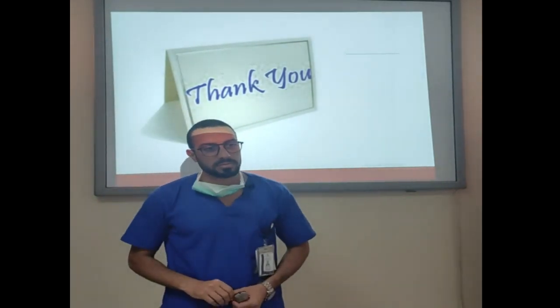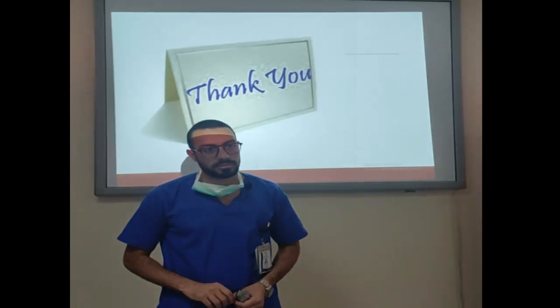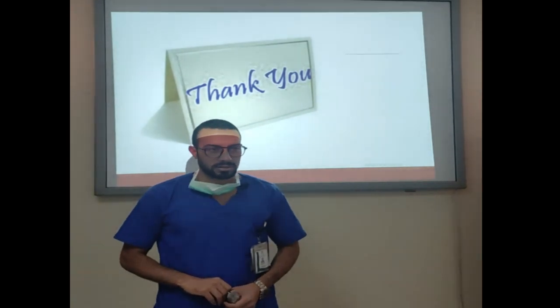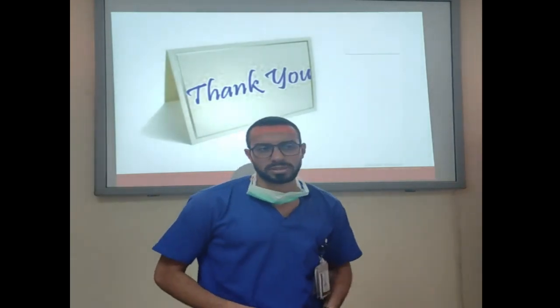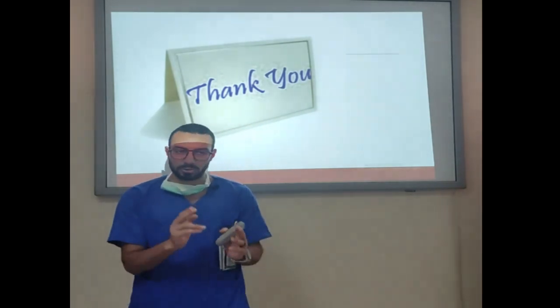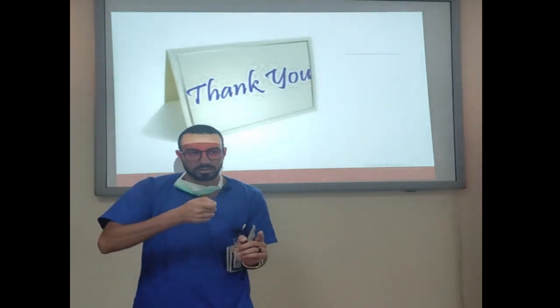If you find the ETT, for example, has been displaced, and you say, for example, it was 24 plus 10 and today you find it 24, will you push it again, or will you call the doctor? Call the RT. Because you can do it, but only if you know the technique. But anyway, if you know that it should be 22 from the beginning and it's now 24, you can push it.